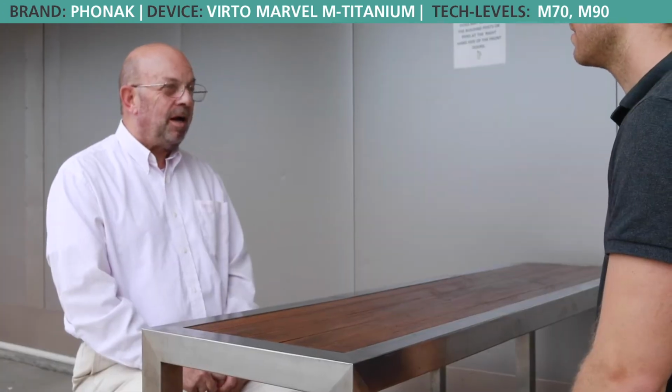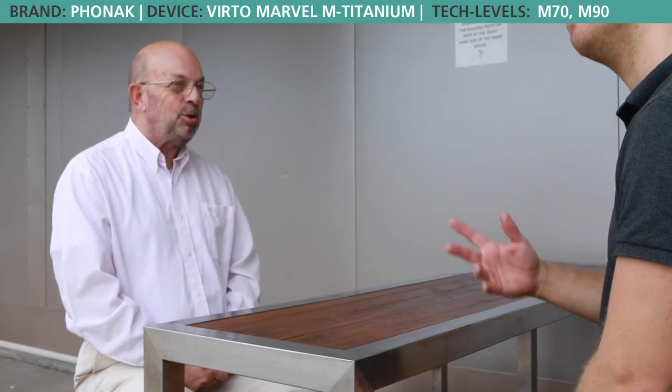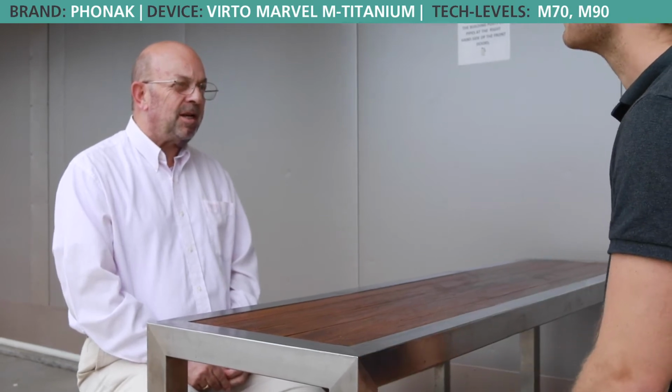Now the hearing aid's microphones pick up the increase in noise in that cafe, and as such then changes the program to best suit the environment to give him the ability to hear better. This provides the wearer with an increased ability to hear in the noisy background. The hearing aid achieves this by using its directional microphones. The microphones adjust the hearing aid to be more directional in their focus, so it narrows the beam.